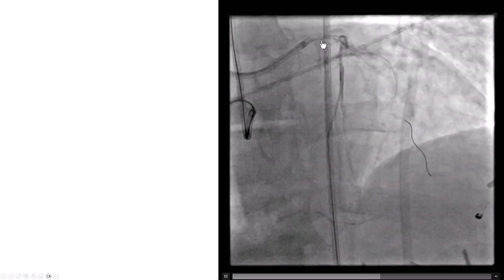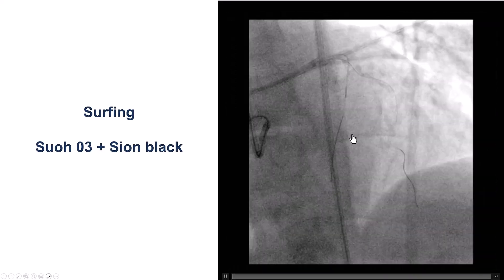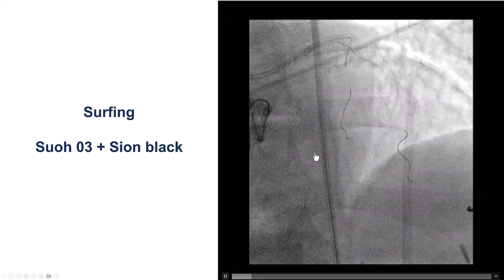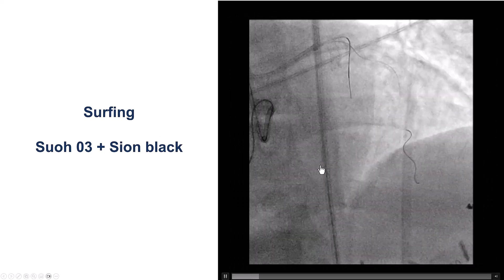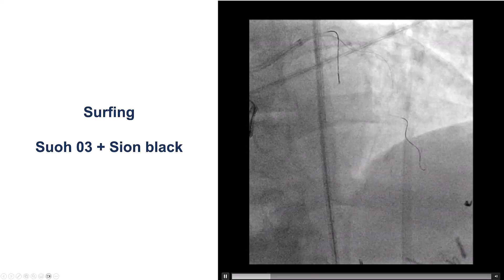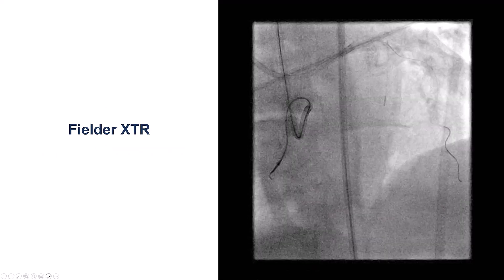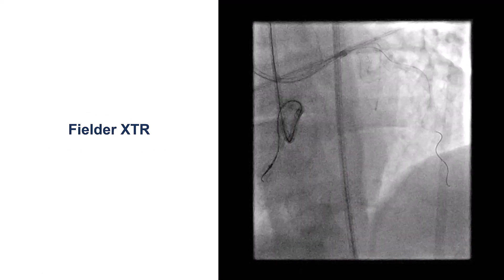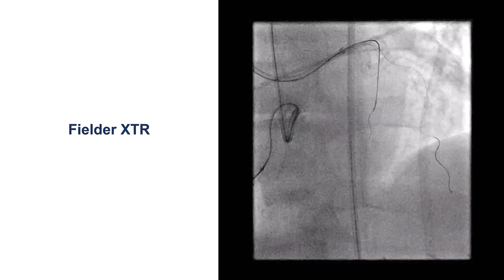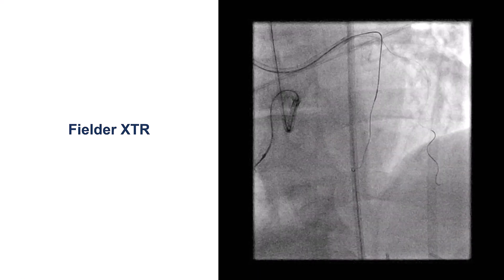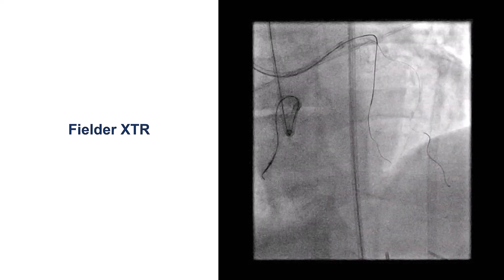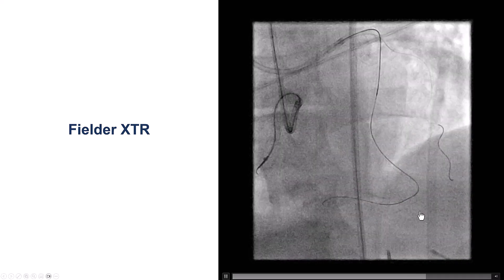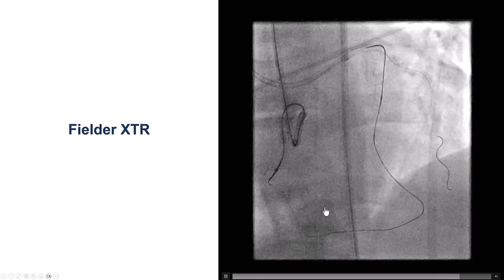After multiple attempts, we decided to switch retrograde through the septal collateral. We did surfing using a Suoh 03 as well as a Sion black guide wire, but had difficulty getting through. We eventually switched to a Fielder XTR guide wire and continued our surfing. The Fielder XTR has a tapered, soft tip and is a polymer-jacketed wire. With surfing, it followed a pathway more towards the apex and then successfully crossed into the right PDA.